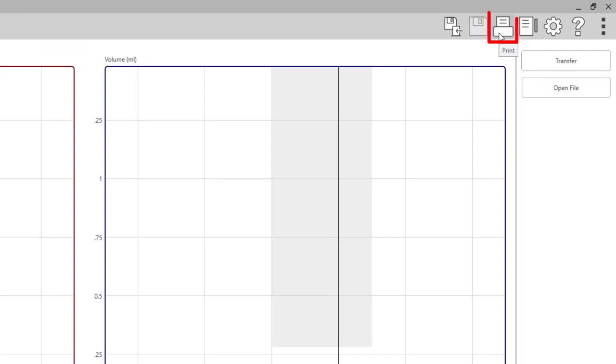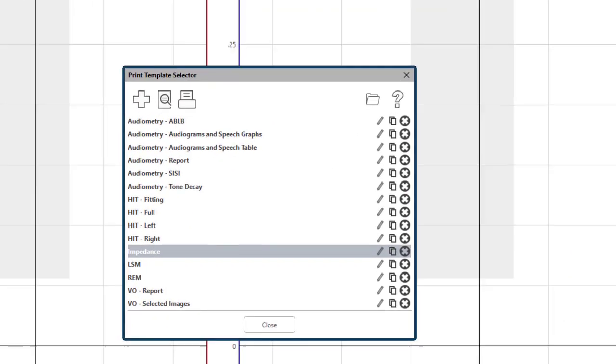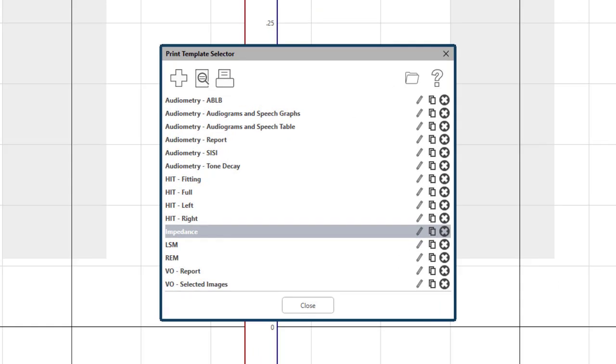This is the print icon. Select print and there will be sample print templates available for you. You can also set up custom templates here.